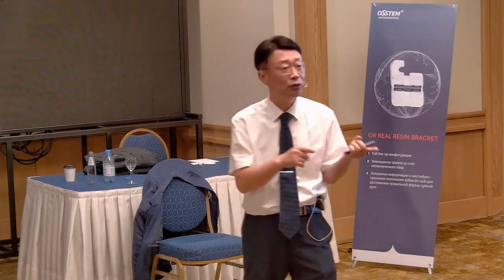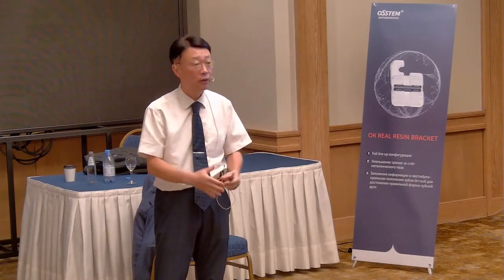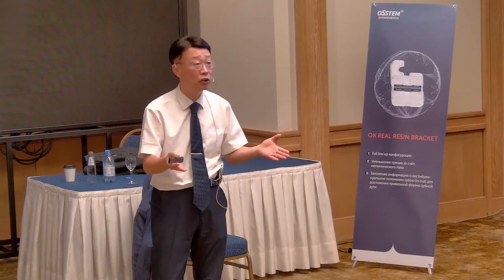Seniors have many problems, but they think orthodontic treatment is for young kids only, for a beautiful smile. But we keep advertising that no, it's for your function, it's for a better life, for the rest of your life until 100 years. Nowadays many seniors are being treated by orthodontists, but when you are trying to do leveling and alignment, it needs retraction and differential movement of each segment. During that time, the mini screw is very crucial.